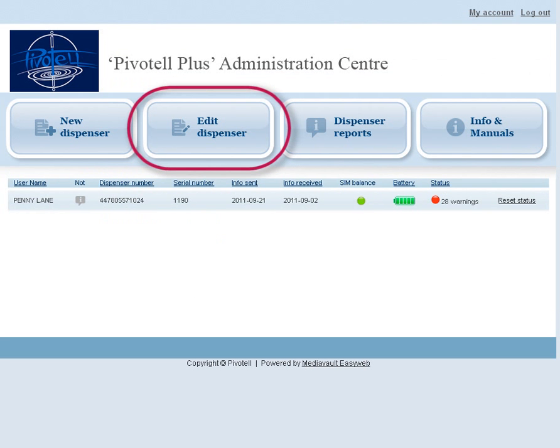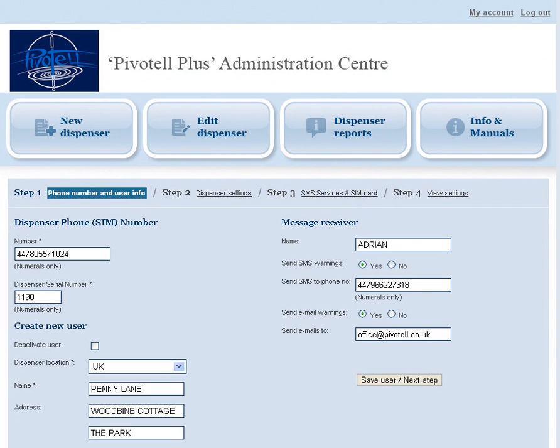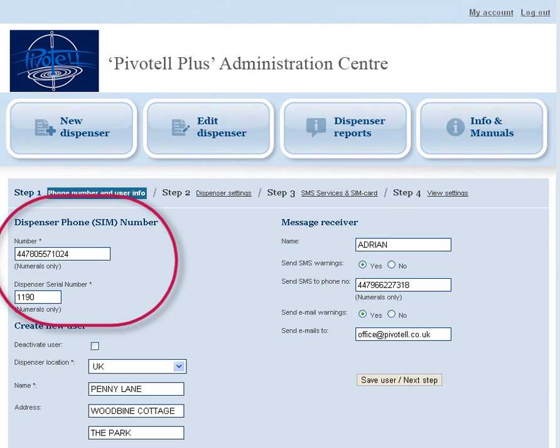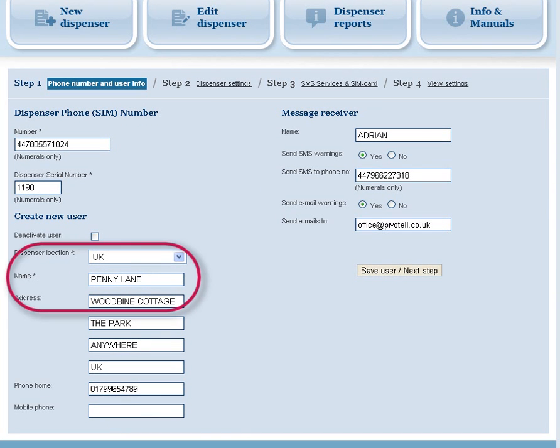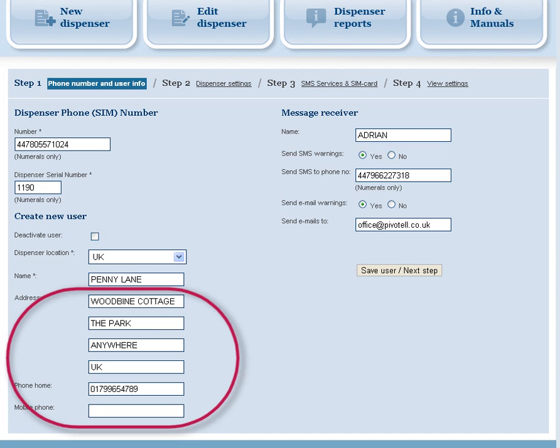Click the Edit Dispenser button and complete Step 1 of the on-screen details. The dispenser phone number and serial number will already have been filled in. Add the name or other identification of the dispenser user. This name will be displayed in the SMS message together with the message. Add also the user's address and contact details.